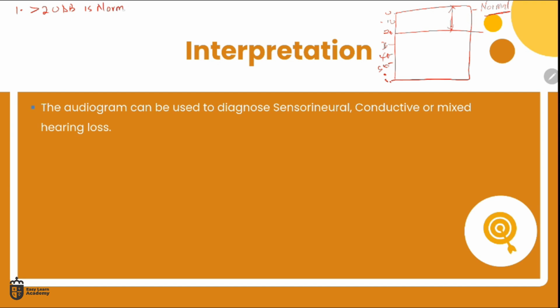So if you see any audiogram, and you can see that there's a graph plotted within the 20 decibel there, that's normal. Don't worry about it. Just choose normal in an exam. Or if it's a patient in front of you, tell them this is fine. And that's it. So that's the easiest point from the 4 points I'm going to say today.